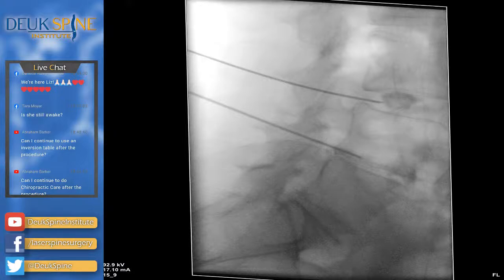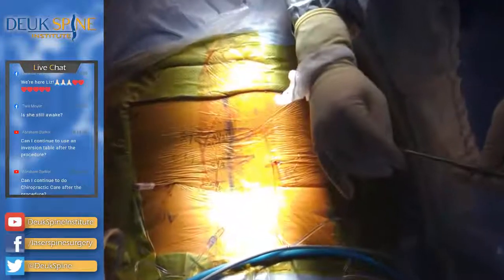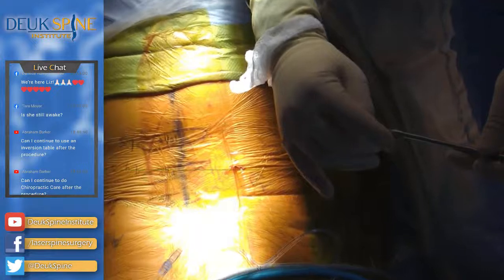It looks worse to you? Oh, but it is narrow. I'm looking at the pedicles. I'm looking at the pedicle of 4 and the pedicle of 5. That's what tells you the truth. Yeah. Well, we know we did a discogram, so I feel pretty confident about our location. And she had pain. And this is just a very collapsed space.